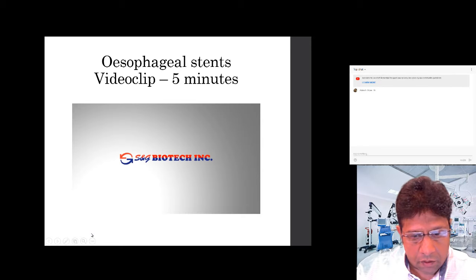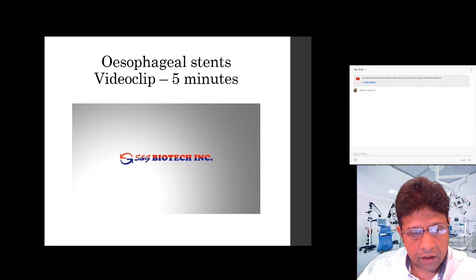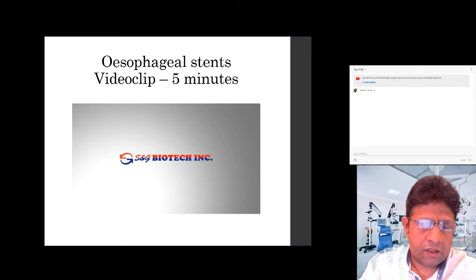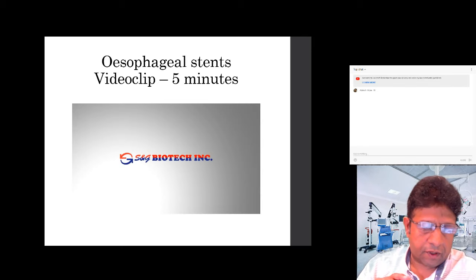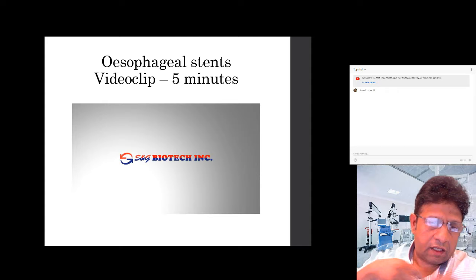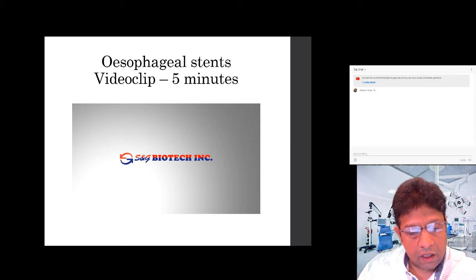Okay, that's quite a commercial video, but it does actually explain the stents quite nicely. As far as I know, we don't actually have this company in South Africa, S&G Biotech. The typical stents that I have seen are Boston Scientific, and they are usually covered by a silk thread. Instead of withdrawing a catheter from the stent, you actually pull the thread and it unwinds and releases, and then you get proximal release and distal release.